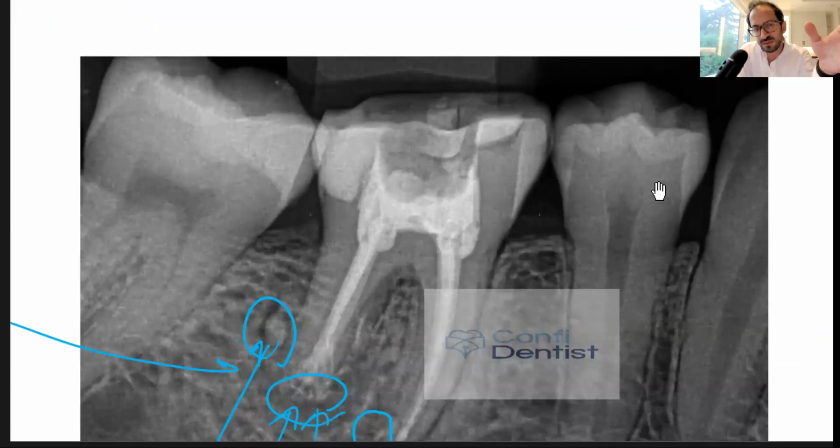With this appearance, it's too risky. What about attrition on tooth 4-6? That's a very good question. I don't choose attrition here because the tooth is severely restored. And I look at the adjacent teeth. Actually, look at the adjacent teeth. Look how the cusps look normal. So it's very unlikely that you have attrition only on one tooth. Attrition is more like a generalized pattern, okay?